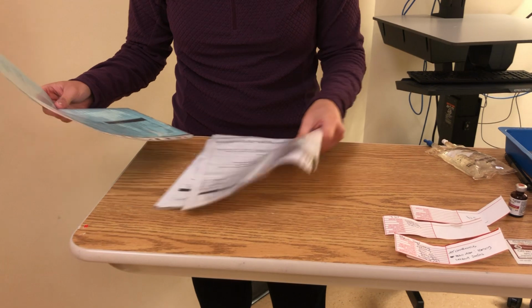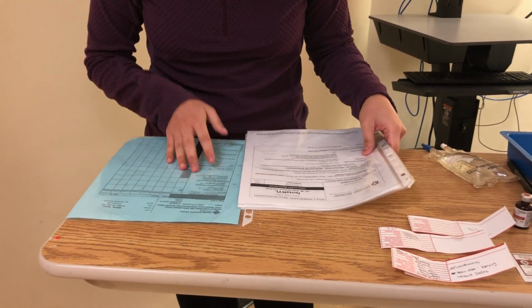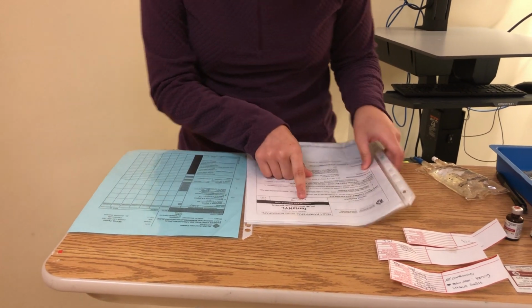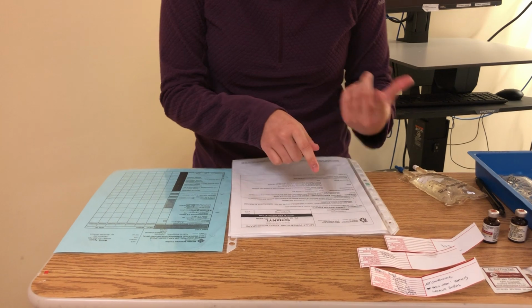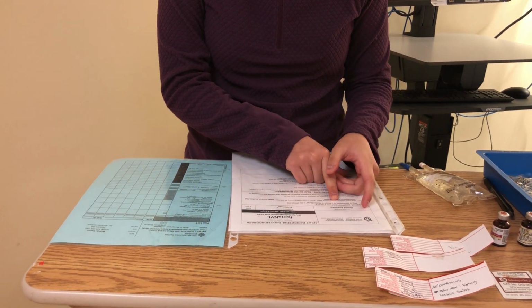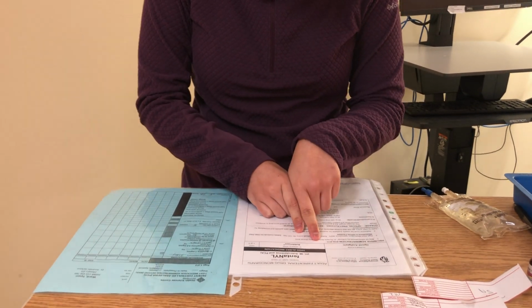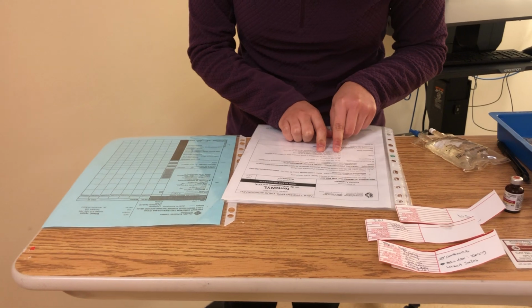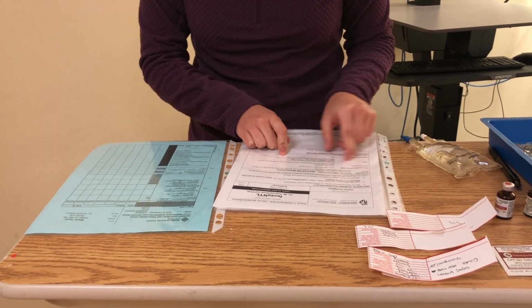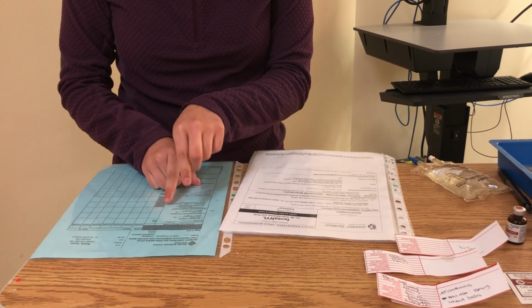And now I'm going to review my PDM. So this is fentanyl. It's a high alert medication, so I know that I need a nurse check for this. It is an opioid analgesic, which is appropriate for the patient's condition, which is pain. It can be administered by a student nurse. So the usual dose for PCA is 10 to 50 micrograms with a lockout interval of 5 to 10 minutes. So I know that we are within the safe dose range.